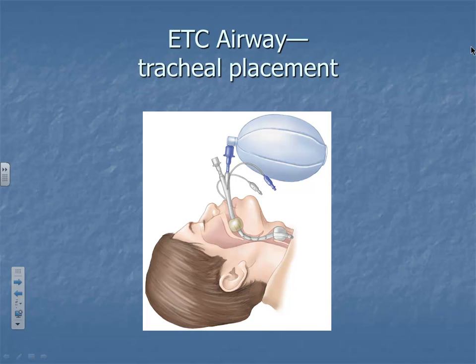I think that's what that means. And you can see here, now y'all did the combi tube in advance, right? So you should be familiar with this. You can see that if you're really, really lucky, you put this thing into the trachea. What are the chances of that happening? Really poor. Probably less than 10% of these actually go in the trachea. Otherwise, it's going to go down into the esophagus.